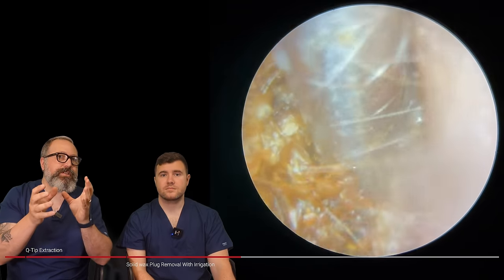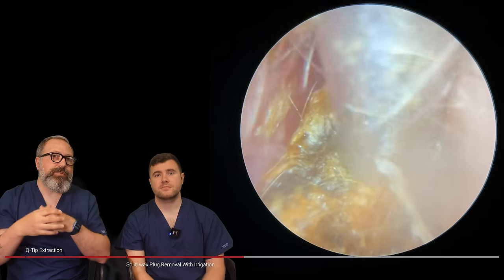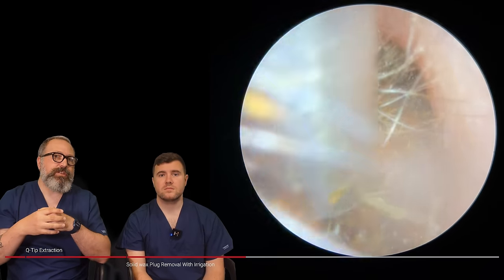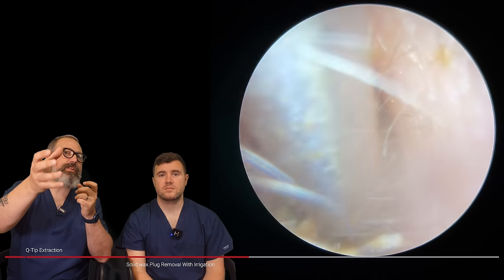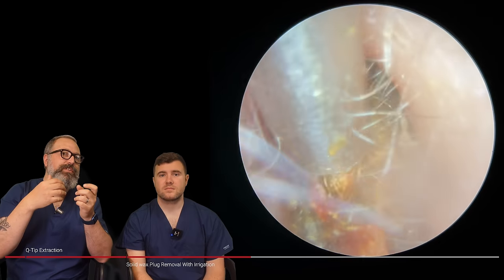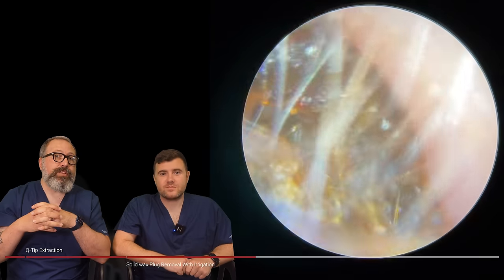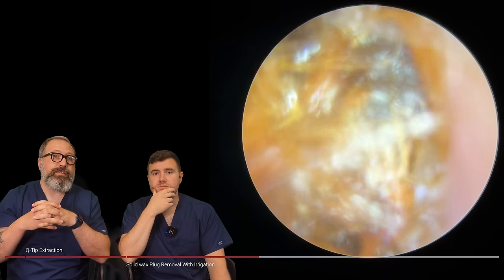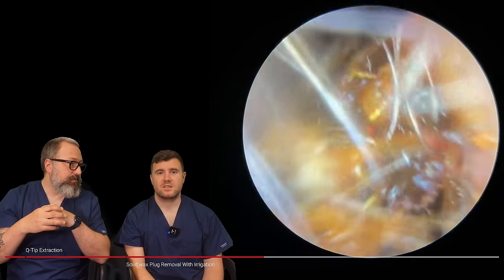When Connor did our training with us, he said like a windscreen wiper motion — and what that does, it creates a vortex in the water, so it tends to draw a lot more of the wax down. We're always looking at the clarity of the water, making sure it's nice and clear, that it's not causing any issues. But you can see it's broken that wax down and changed the consistency. These two different methods can really complement each other — you can really change that consistency of wax, it makes it so much easier to get in there. It's brought that plug forwards a little bit more, which is just going to help us get better suction grip on here. Just to reassure you — we do see the plug coming out at the end.